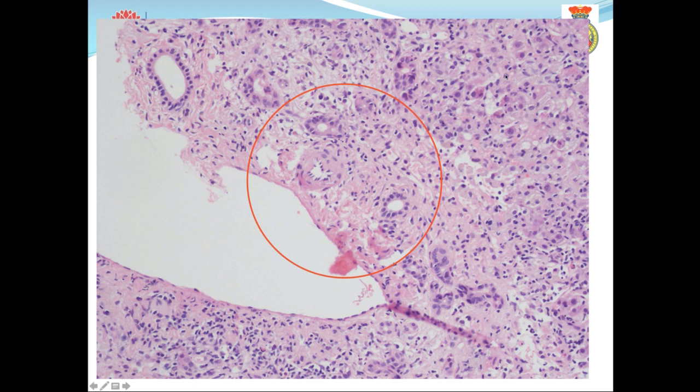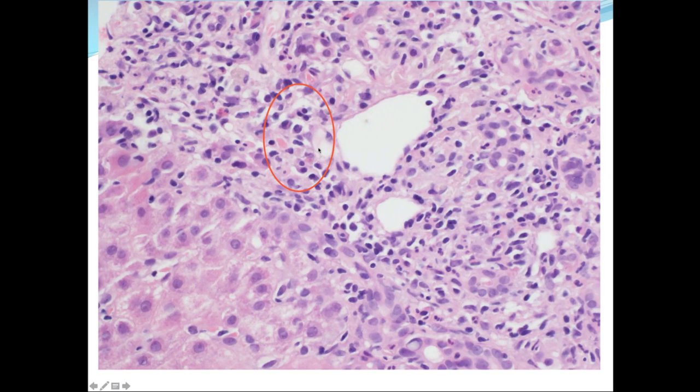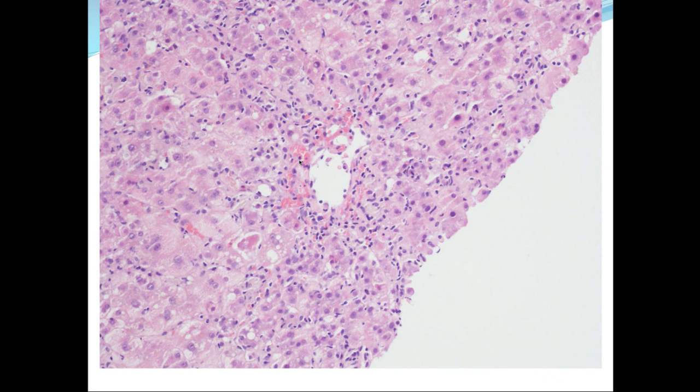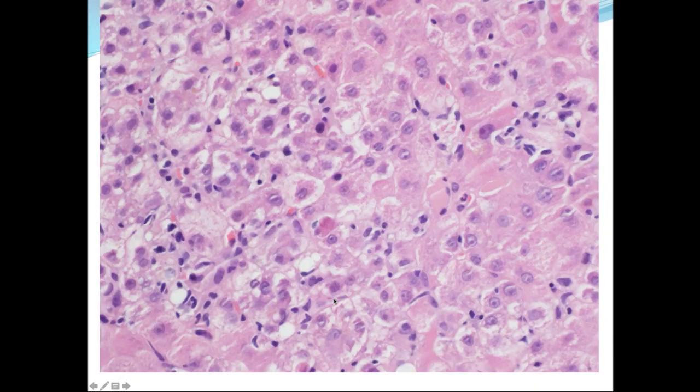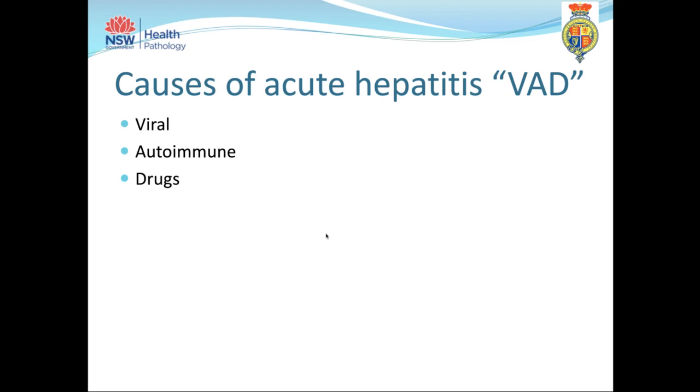Always important to check for the presence of the interlobular bile ducts, which were there with some appearing a little damaged. Inflammatory infiltrate in the portal tracts, you can see, is quite dense with scattered plasma cells present. Quite marked perivenulitis, with some perivenular necrosis, as well as quite substantial lobular disarray with inflammation and scattered apoptotic hepatocytes.